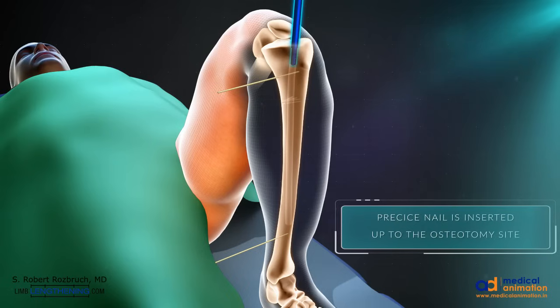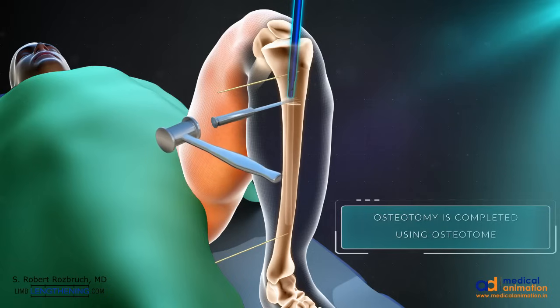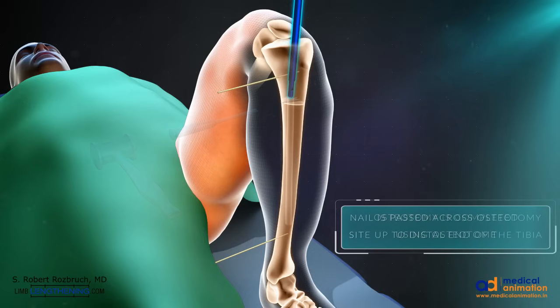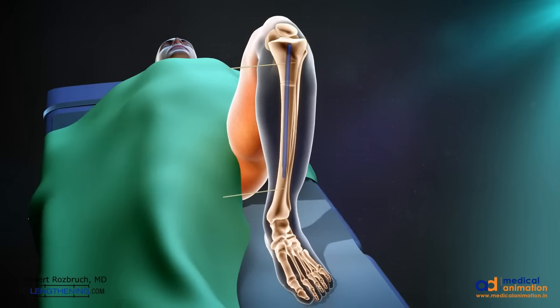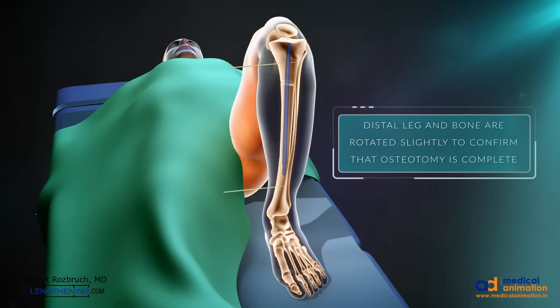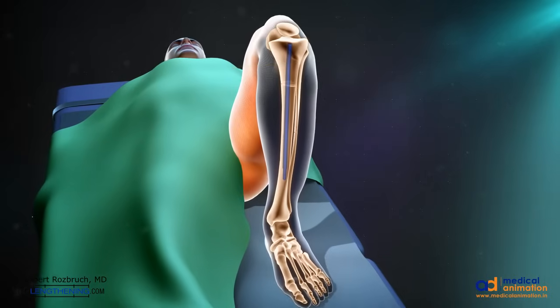The nail is inserted up to the osteotomy site, and an osteotome is used to complete the osteotomy. Once this is done, the nail is then passed across the osteotomy and optimally seated. The bones are rotated around the intramedullary nail to confirm that the osteotomy is complete, but the rotational markers make sure that rotational deformity is not created.